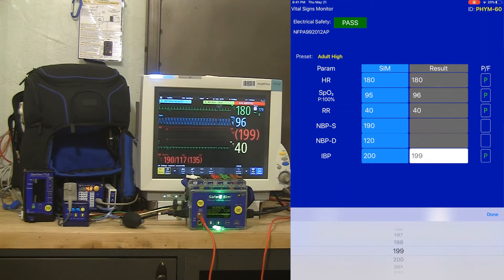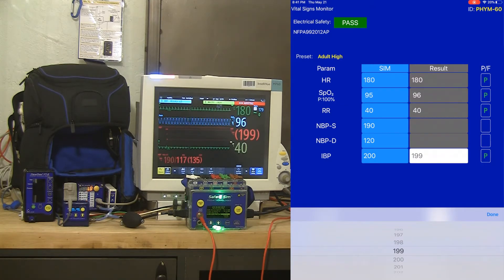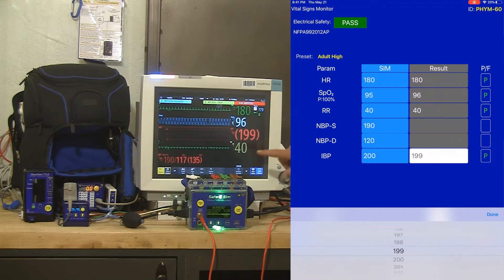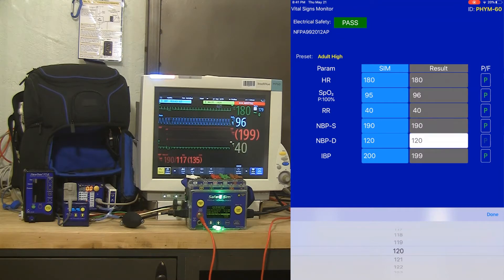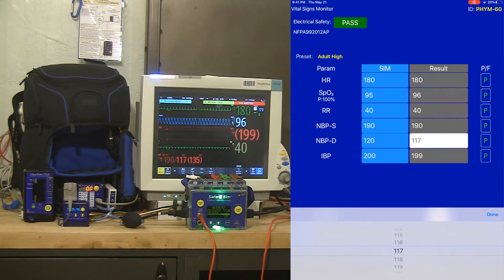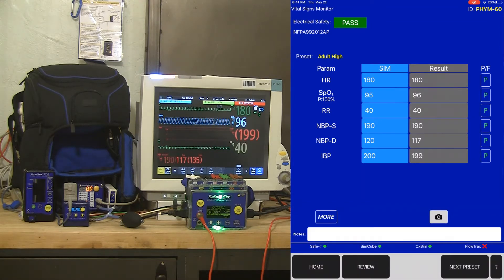All of those parameters, as soon as we got on the screen, were immediately set on the test equipment because of that Bluetooth connectivity. I've got a NIBP reading now of 190 over 117, so I'm going to tap that in, and I'm good to go. All of those parameters are tested and passed.